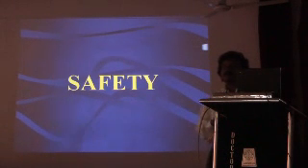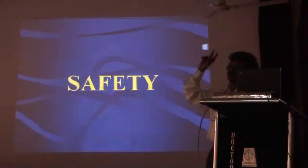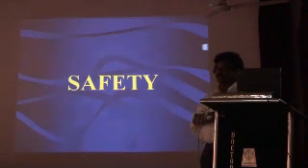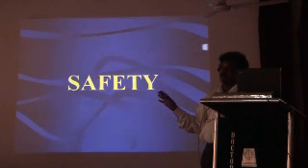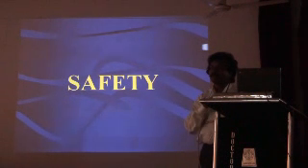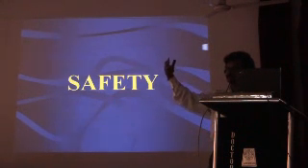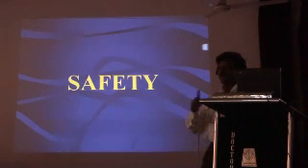Before 1970, all those aneurysm clips were ferromagnetic, and nowadays all are MR compatible. Nowadays the pacemakers are also protected for MRI. In fact, an MR compatible pacemaker is available in the states.